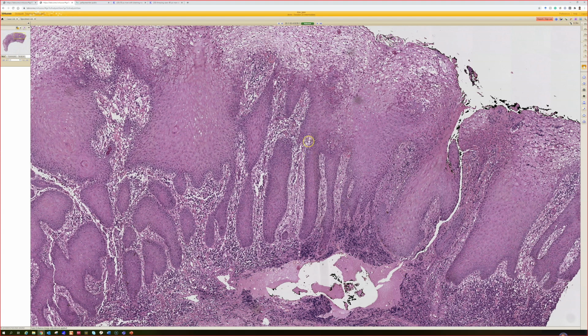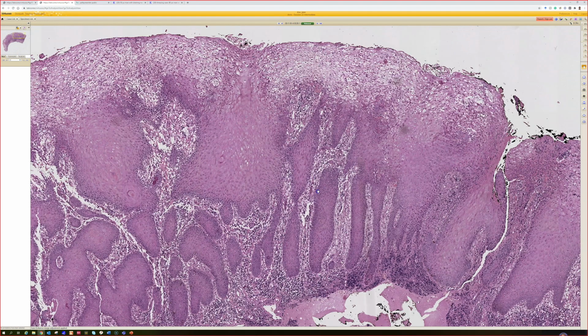I don't find them very often. They don't, to me, look very much like Condyloma acuminatum, which of course is the HPV-driven genital wart. But they do clinically look kind of like that. I feel like they tend to be more flat plaque-like rather than vegetative, warty looking. I've seen pictures that look more warty, but the ones I've seen in practice were elongated plaques, and all the ones I saw were in genital skin or perianal skin.